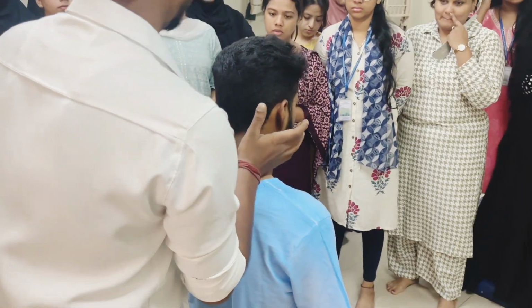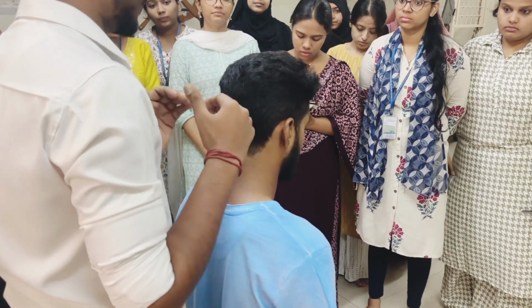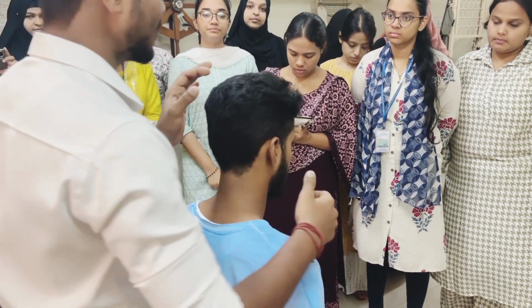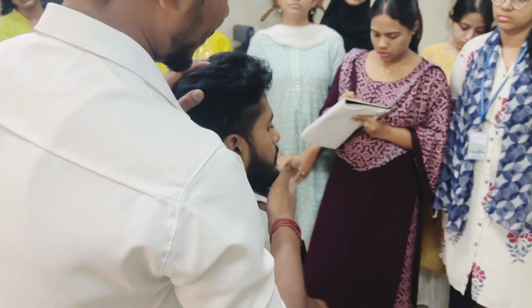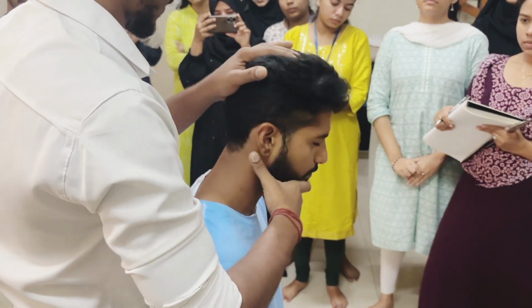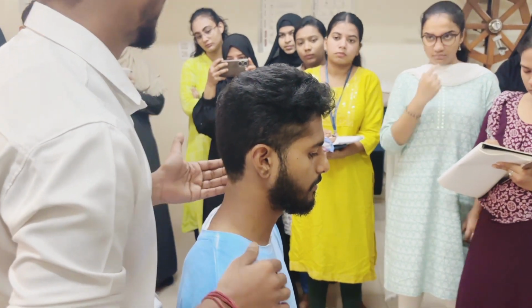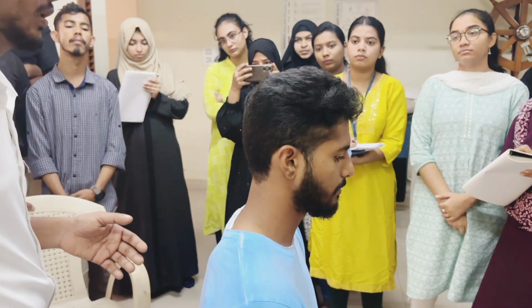Now we are going to measure cervical spine flexion. Before doing that movement, first we have to do passive flexion once. So here I did passive flexion once. Now the patient knows what that movement, passive flexion, is. After that we have to measure range of motion with the goniometer.